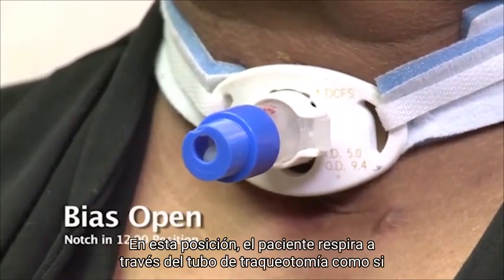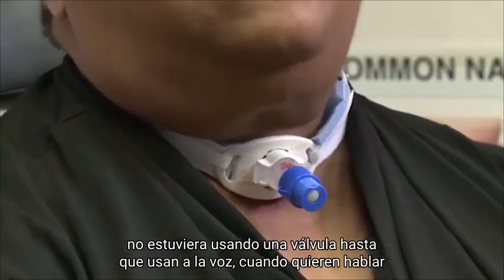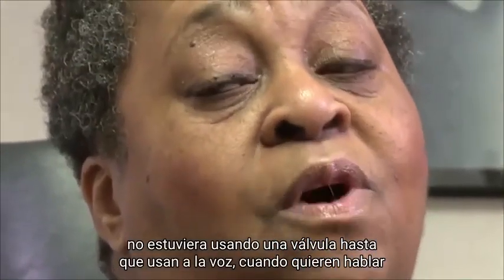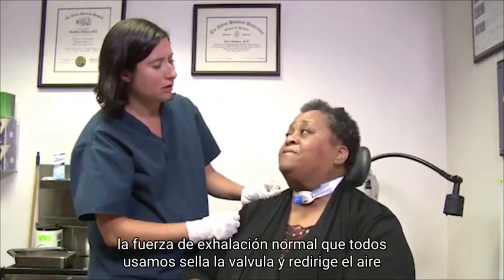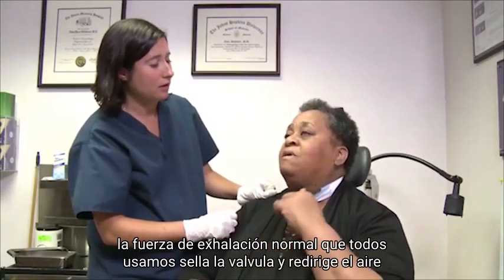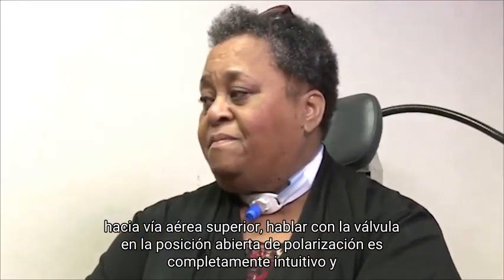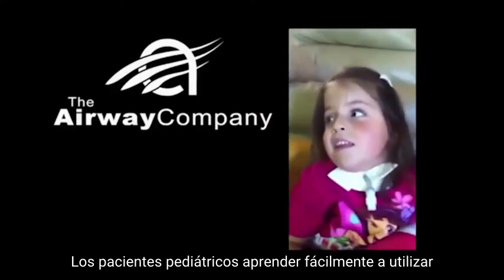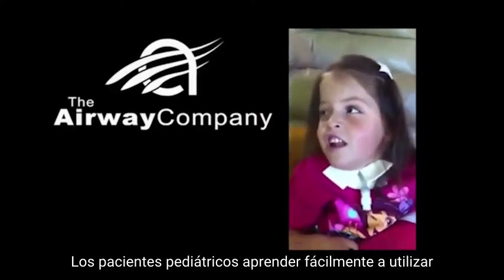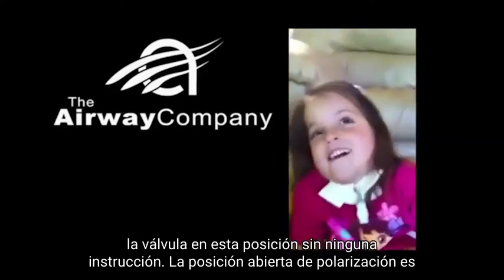In this position, the patient breathes through the tracheostomy tube as if they're not wearing a valve until they go to voice. When they want to voice, the normal exhalation forces that we all use to voice seals the valve and redirects air into the upper airway. Voicing with the valve in the bias open position is completely intuitive, and pediatric patients can easily learn to voice using the valve in this position without any instruction.